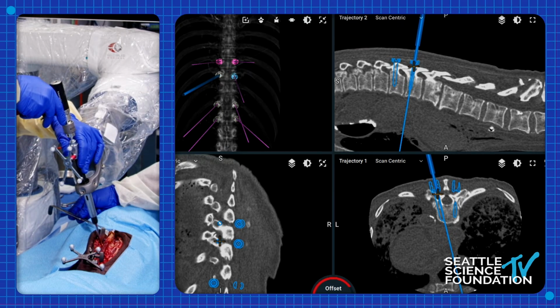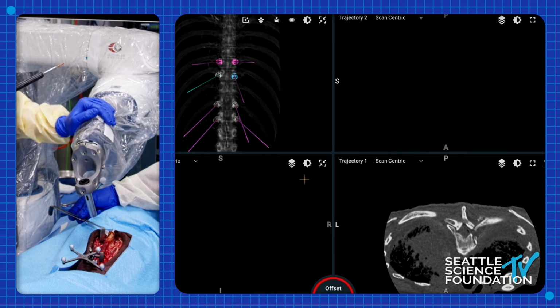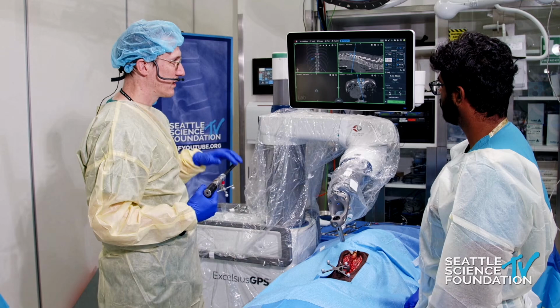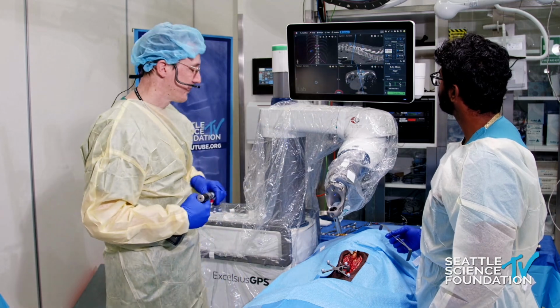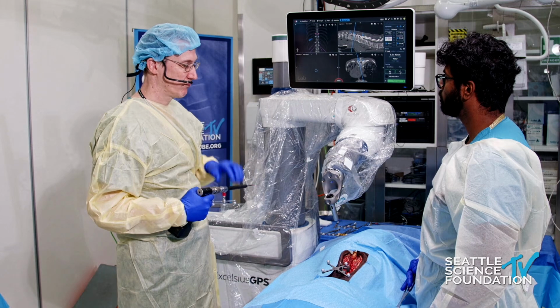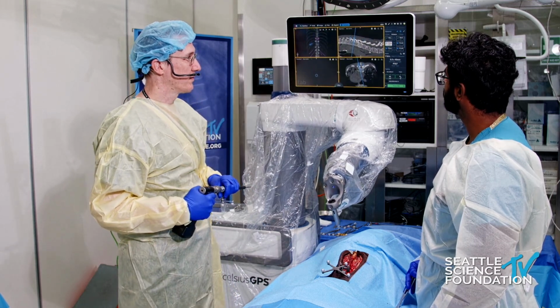Now let's just say at this exact moment, somebody bangs onto the arm. That's right. All we do is resend it, and it'll go right back to where it needs to go. We can move it out of the way and just put it right back. And sometimes the rechecks are just what you need to do. Get it on and reassure yourself.